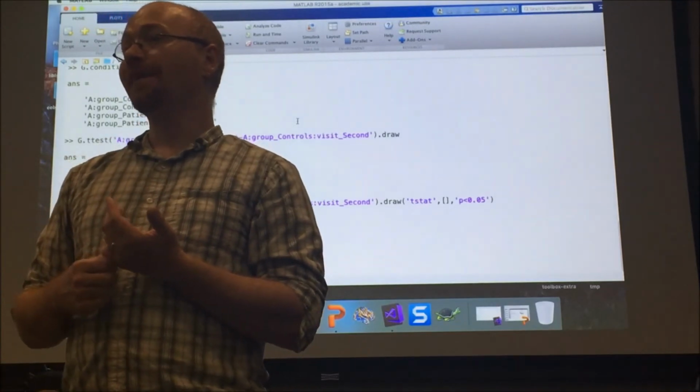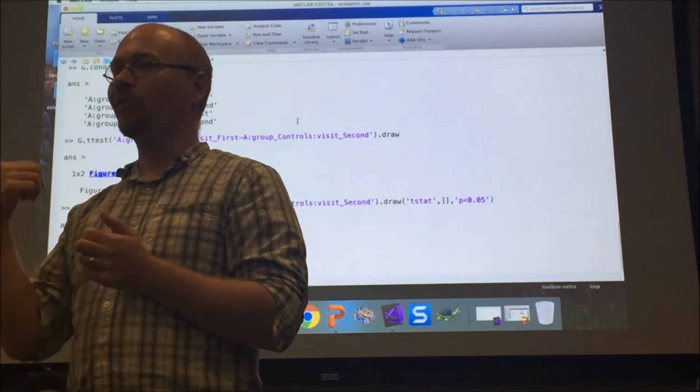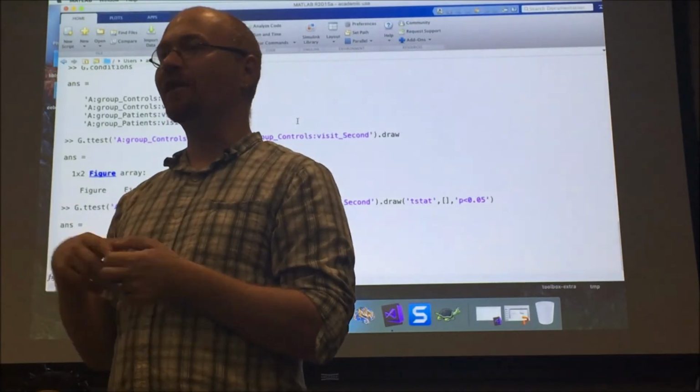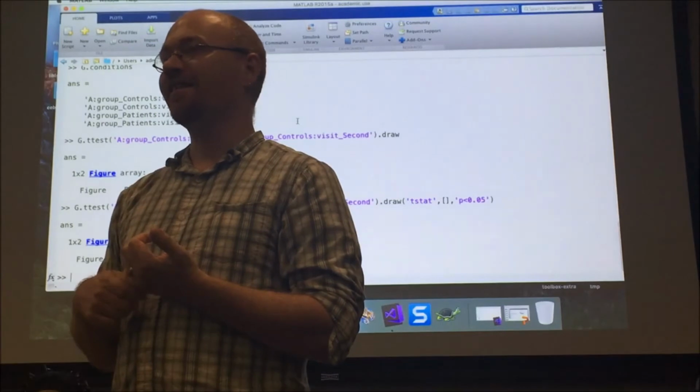If you dig closely enough through my toolbox, there are hints on how I plan to do that, because there are modules that do some of that registration and recorrect for head size, but it's not established yet at all.